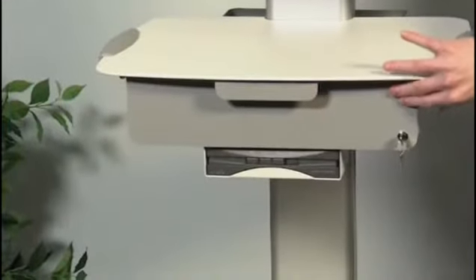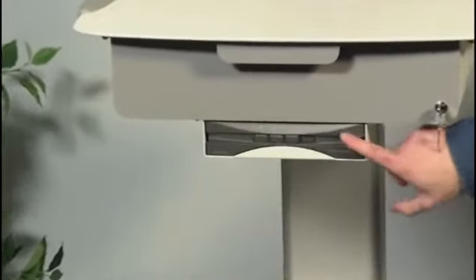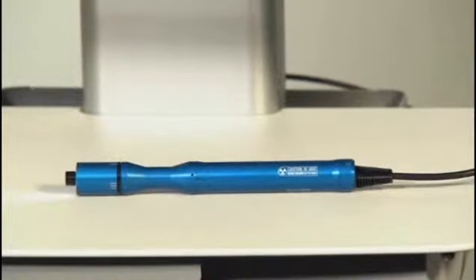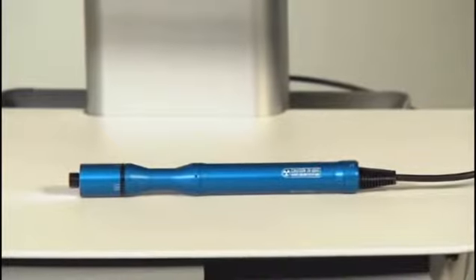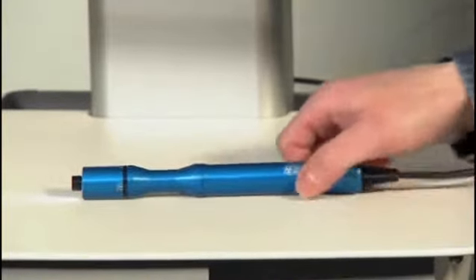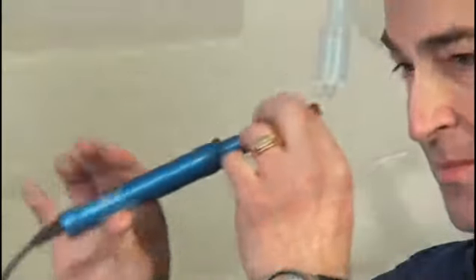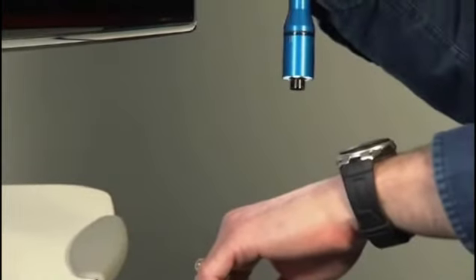I want to point out one feature of the cart, which is a video switch. The video switch is important because you'll be able to connect and select medical peripherals as you need to use them. So, for example, the total exam camera is attached to the video switch, and you can pick that up and then use it to examine the eye or perhaps a dermatological lesion.